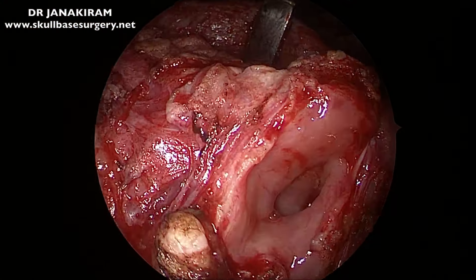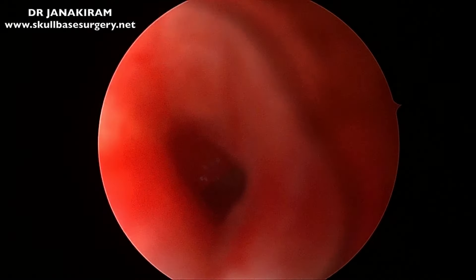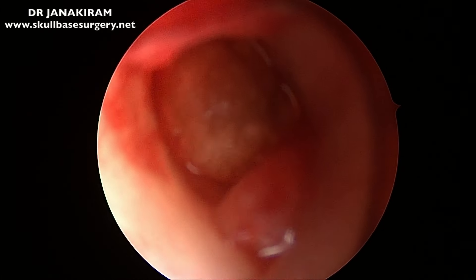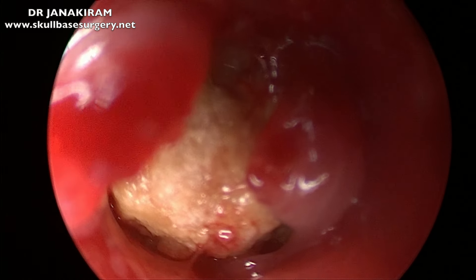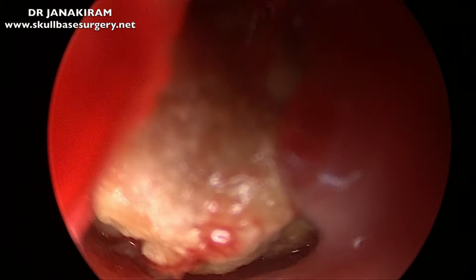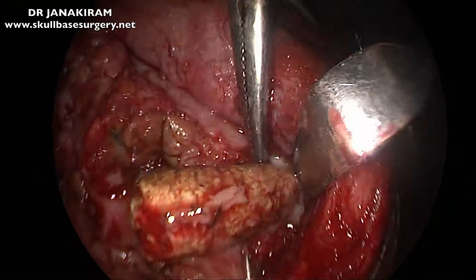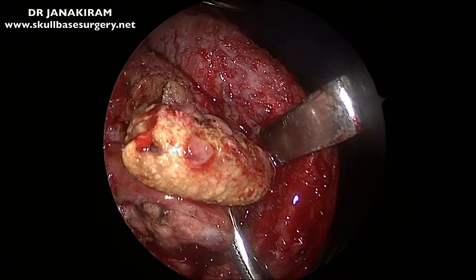You can see now that that is the duct, and now we are putting our endoscope inside. You can see the stone there. This was something very new in this particular case, and that is why we thought we will post this case. You can see that this was the stone — you can see the granulation tissue which is there. It was a very huge stone, so we decided to take that stone and then to repair the duct. You can see a brilliant view through the endoscope. I can see the pus coming out. That is the huge stone there — more than 2.5 cm in size — and that was completely removed.